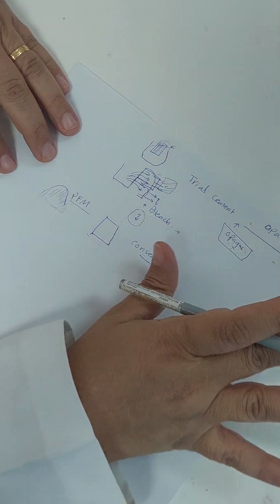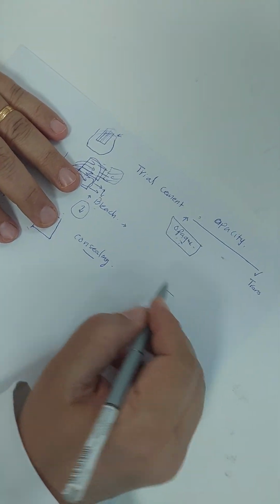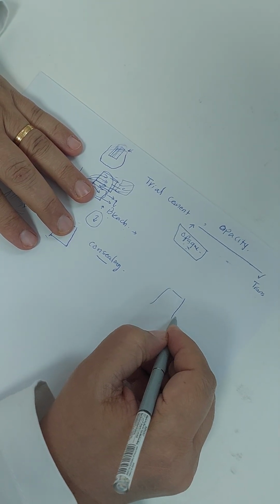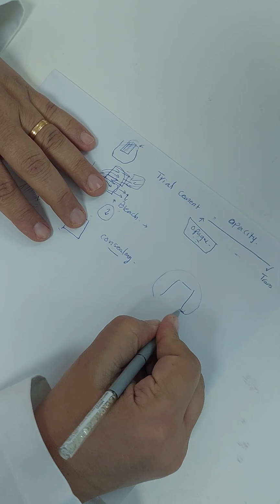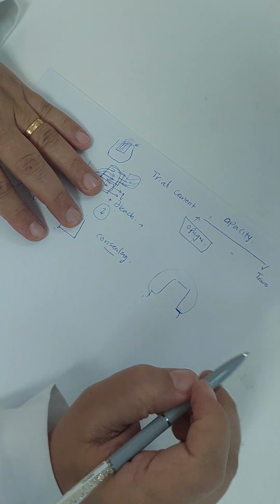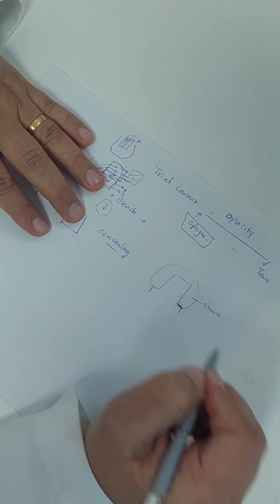So my advice to you as a prosthodontist: please bring a carious tooth, and prepare on that carious tooth, with various degrees of caries, a correct finish line. You and your technician work on playing with the stains. What are the stains that cover underlying color?